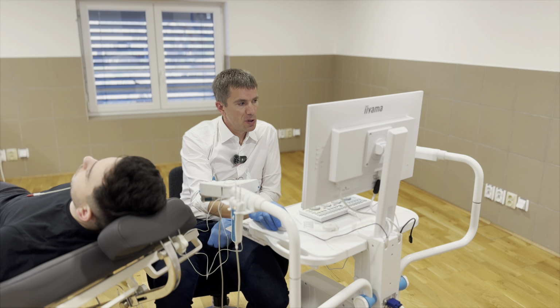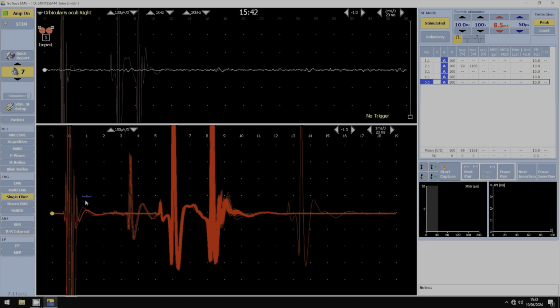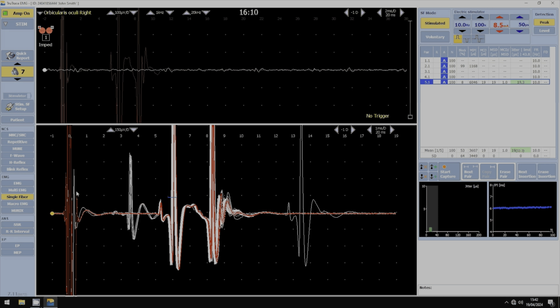Let's look at our response. This is a clear pair of a stimulating artifact and one muscle fiber. So we now want to calculate the jitter between this stimulation artifact and this first muscle fiber. In order to do that, we have to find the two cursors. The first cursor is automatically placed by the computer on this stimulation artifact. The second one is the blue one, which we place on the first muscle fiber that we see. This is a very reliable answer as the peak is sharp and has a high amplitude.